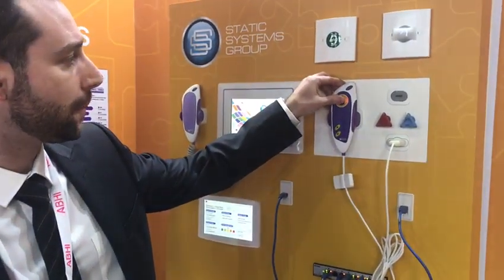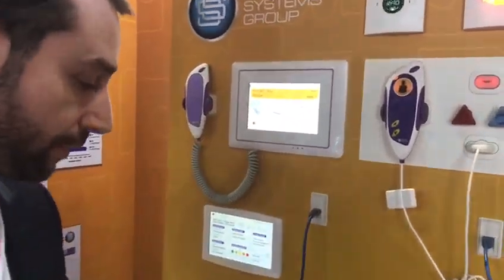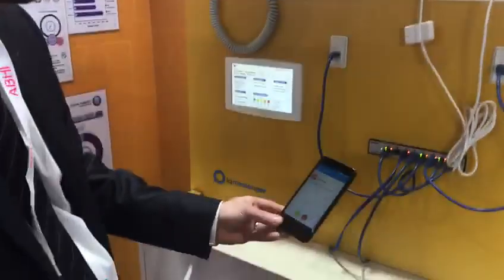So if a patient puts a call up, that message will be raised on the system and it will come through to the IQ Messenger. That can be accepted by a member of staff.